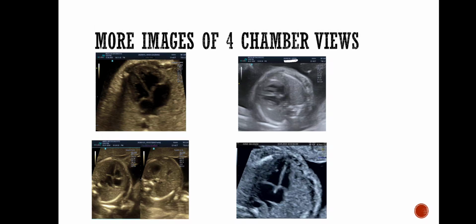More views of four-chamber from different resolution machine: apical four-chamber view and also transverse view.